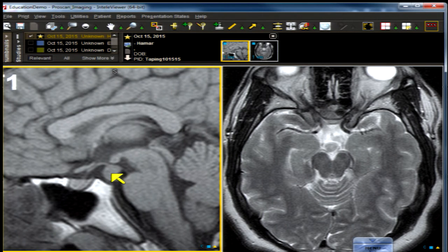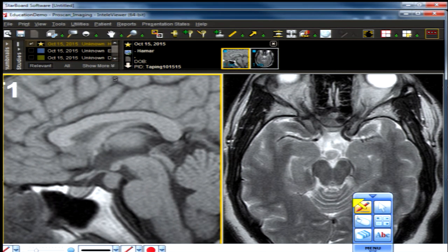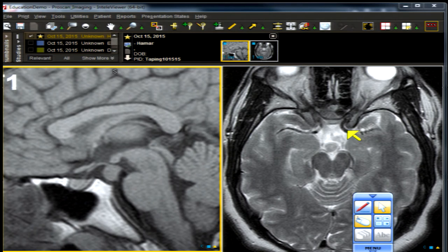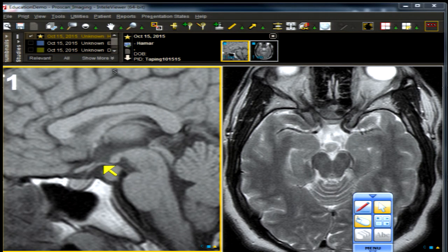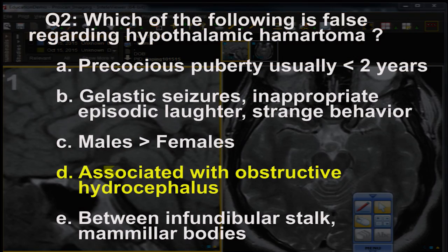It is not a clotted aneurysm. Aneurysms have a laminated appearance consisting of vessel wall, fibrin, and clot. Flow vessels show phase-encoding ghosting — you'd see smearing of signal in the phase-encoded direction across the vessel. You would also see a flow void if there is patency in the vessel, and the aneurysm would be connected to that vessel. Our lesion is connected to the limbic and hypothalamic-pituitary axis via a thin thread — not to a blood vessel.